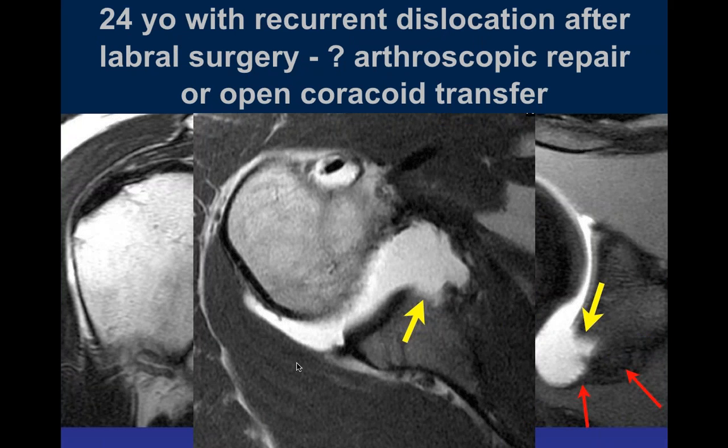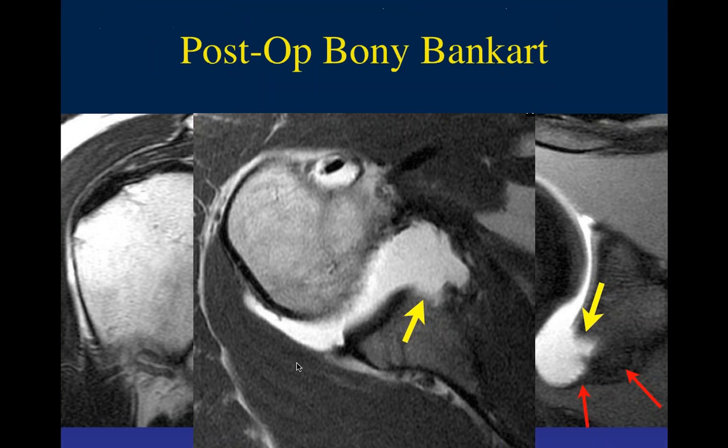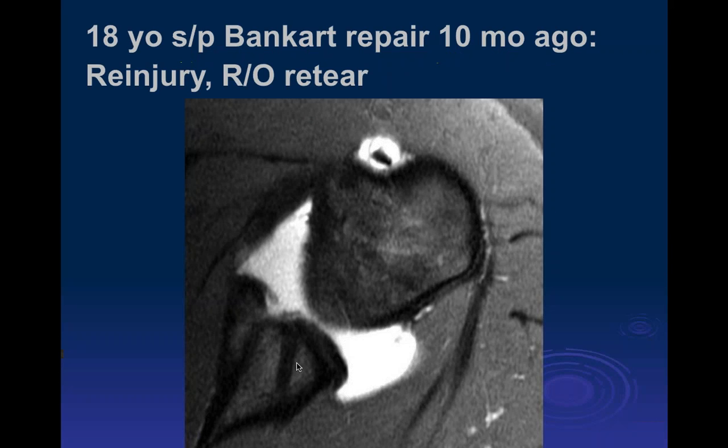I'm saying that this is healed. The bone is healed. It's obviously part of the glenoid that is fractured off. So you have to bring that back and tack it down again, and that's pretty difficult to do. I don't know if the patient wants to go through two different procedures. I knew before, but I've forgotten exactly what they did to this patient after the MR. I don't know whether they tried another arthroscopic procedure or not. I'm sorry, I should remember that.